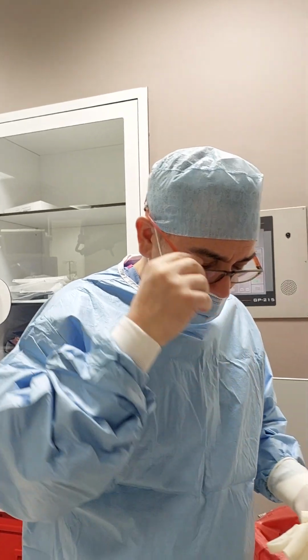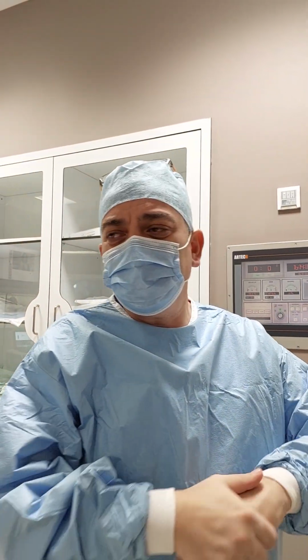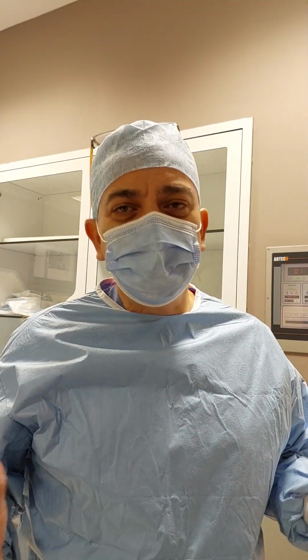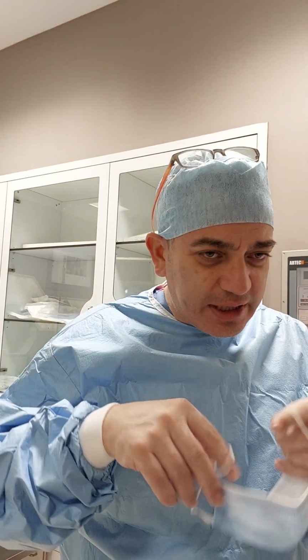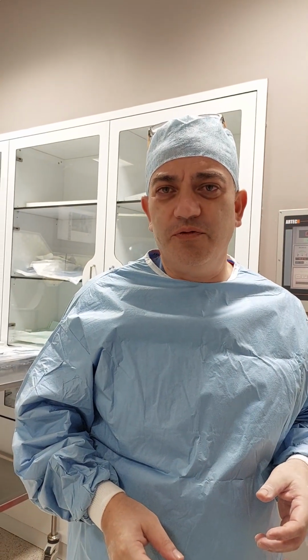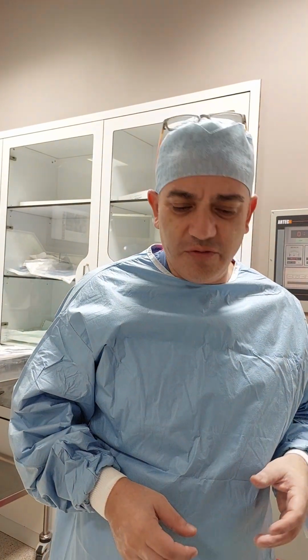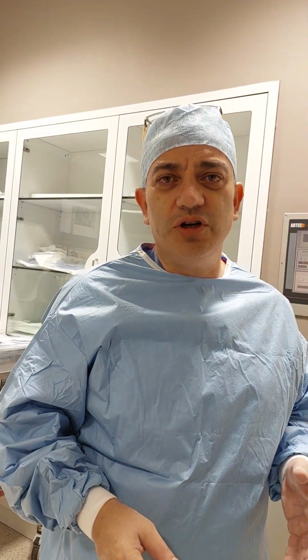Okay, this was a 53-year-old friend from Canada, and he came here saying that he has difficulty in urination, difficulty in sexual life, and some constant pain. So he knows that he has a previous prostatitis diagnosis and he now has BPH symptoms. Altogether, we want to get rid of all of these. Rezum therapy, I can't guarantee the Rezum treatment for prostatitis. Its aim is to open the urethral channel wider, and it's done for obstruction. So we wanted to get rid of this prostatitis with Rezum too, but it's not a guarantee. But for obstruction, I am sure it will be wide open.